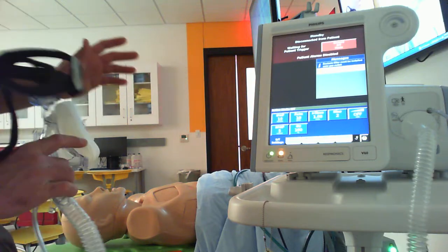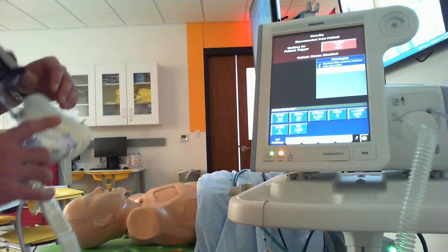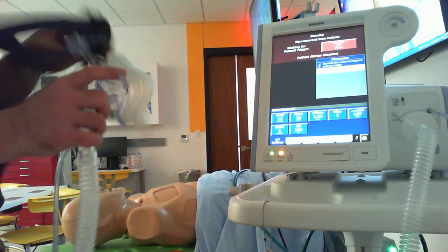I'm using an ASL 5000 lung simulator, so I will need to be able to get back to my screen and make some adjustments that can't be taken care of on themselves as we make changes.